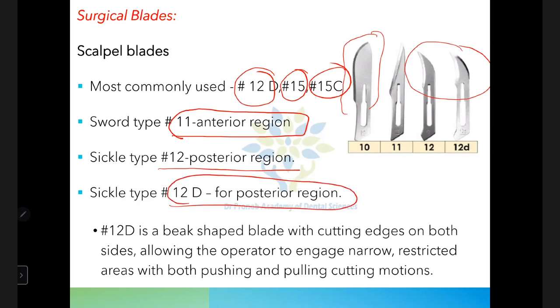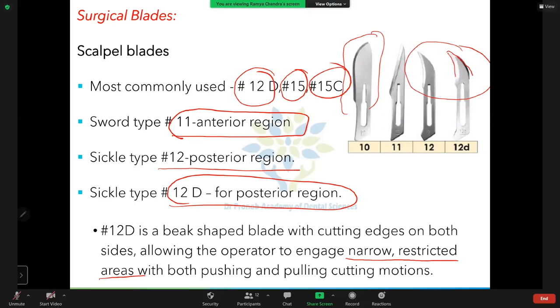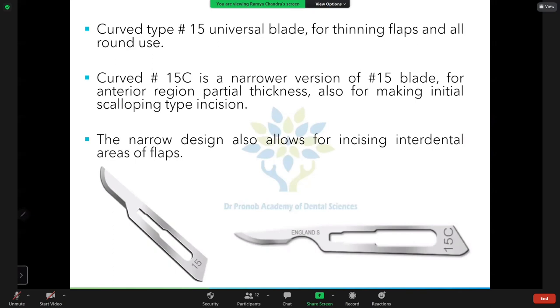Blade 12D is also used in the posterior region. The difference between 12 and 12D is that 12D has cutting edges on both sides, allowing use in narrow interdental areas. Both 12 and 12D are used posteriorly, but 12D can engage narrow restricted interdental areas.